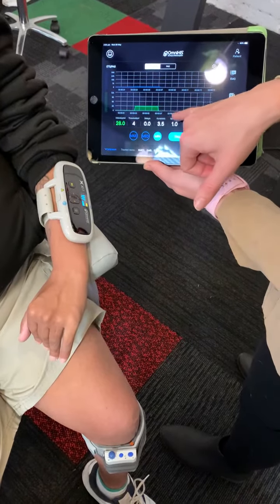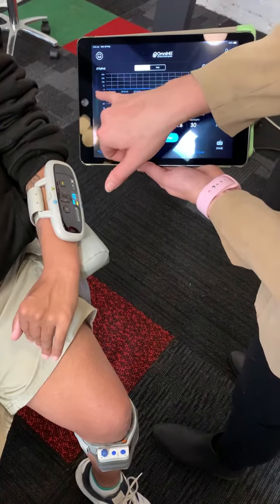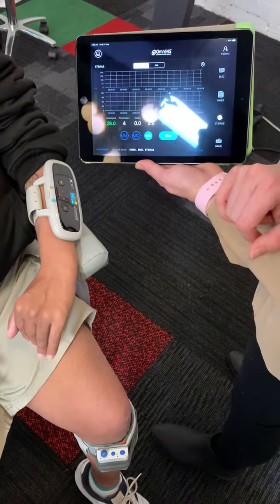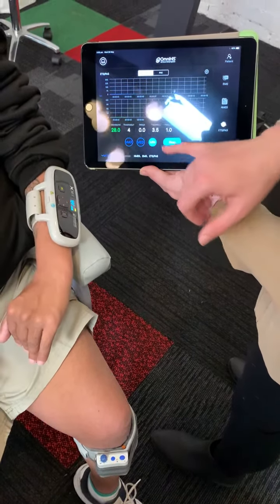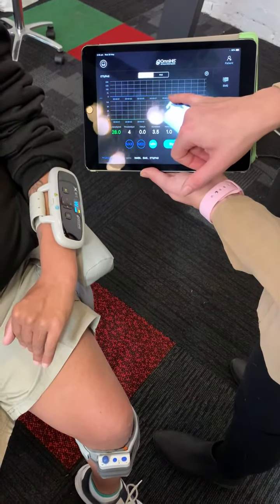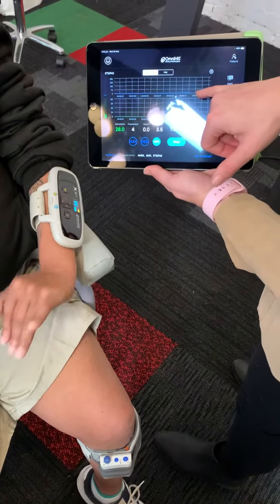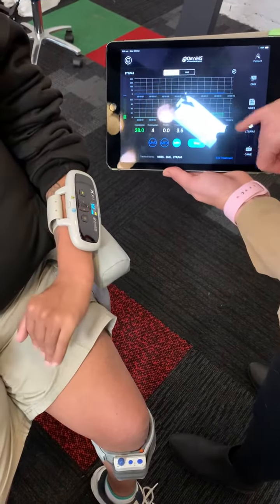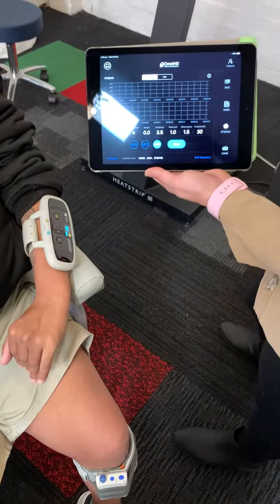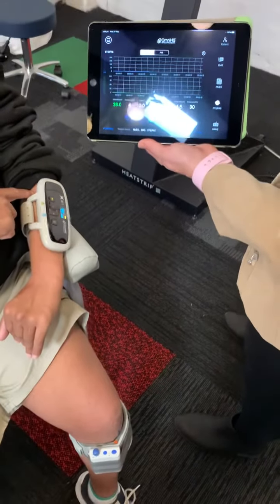We'll drop off — we're flickering here. See if you can do a nice big pulse and we'll see if we can get another stim. So can you think about what you do when you produce that movement? What is it that you're thinking of? Just trying to get that muscle there to fire.